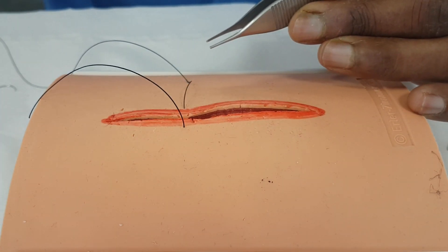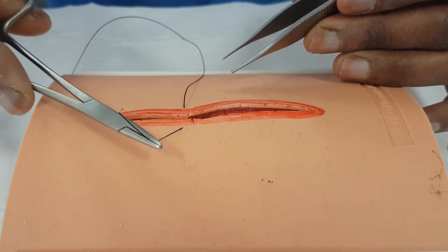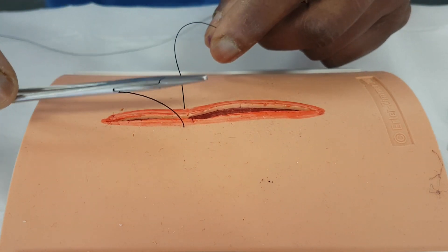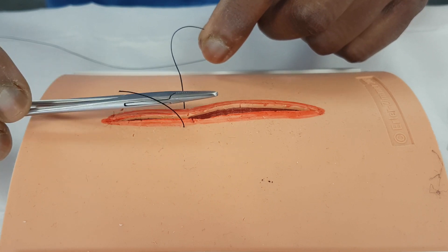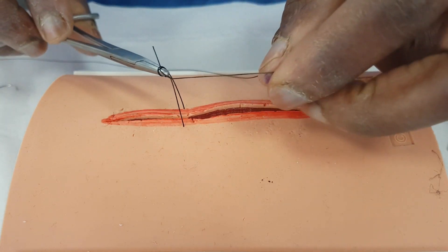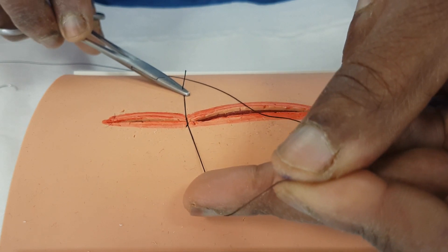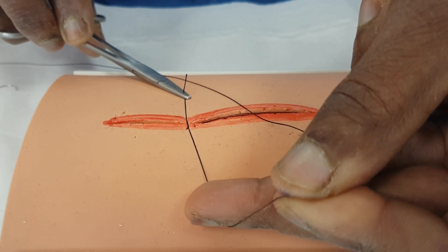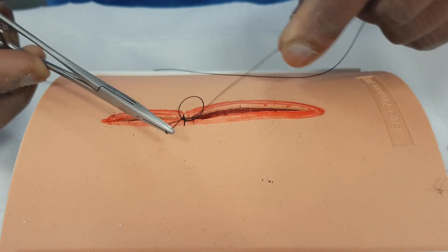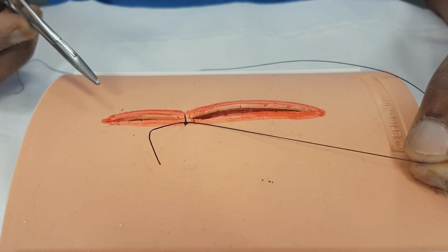Now I need to close that wound. As I'm pulling that through, I can put the needle holder down for a minute and pick up my stitch just here. You put the needle holder inside, parallel to the wound, and I make one throw, make two throws. I then take the end of the stitch and as I bring it across — if you watch — you'll see that knot is coming square against the wound. I let go, make another loop in the other direction, and as I tie, that knot is square. So that stitch is now made, it's done.